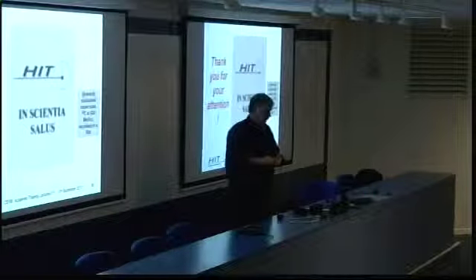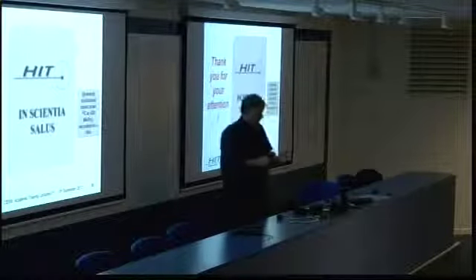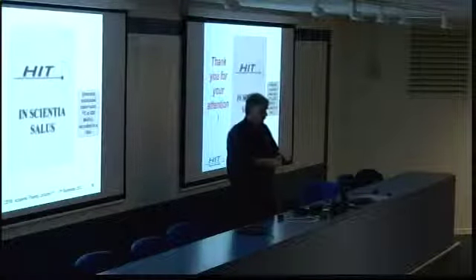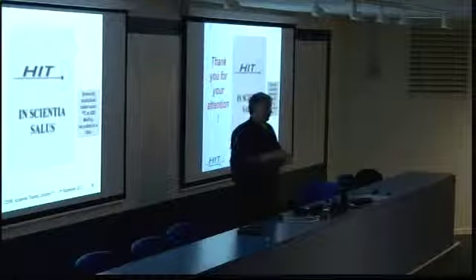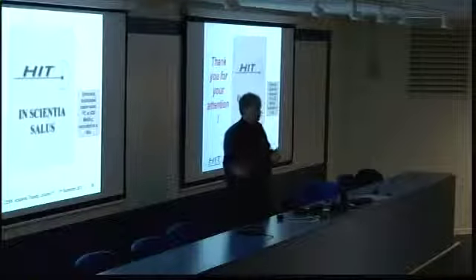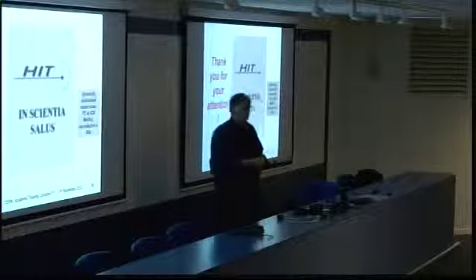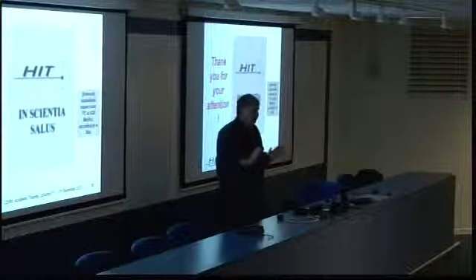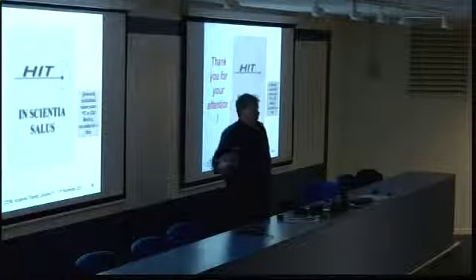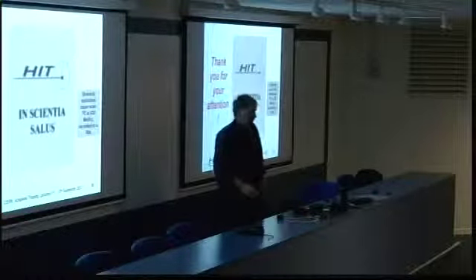And the last point, maybe a problem. If you have very long magnets, you also have problems with eddy currents. So I don't know how long the time is for switching from one magnet field to the other, from one energy to the other. This may also be a problem. I don't know it exactly for the Loma Linda version, but I think these could be the reasons. It's always astonishing that this first machine installation of a proton synchrotron with everything around it was never copied.